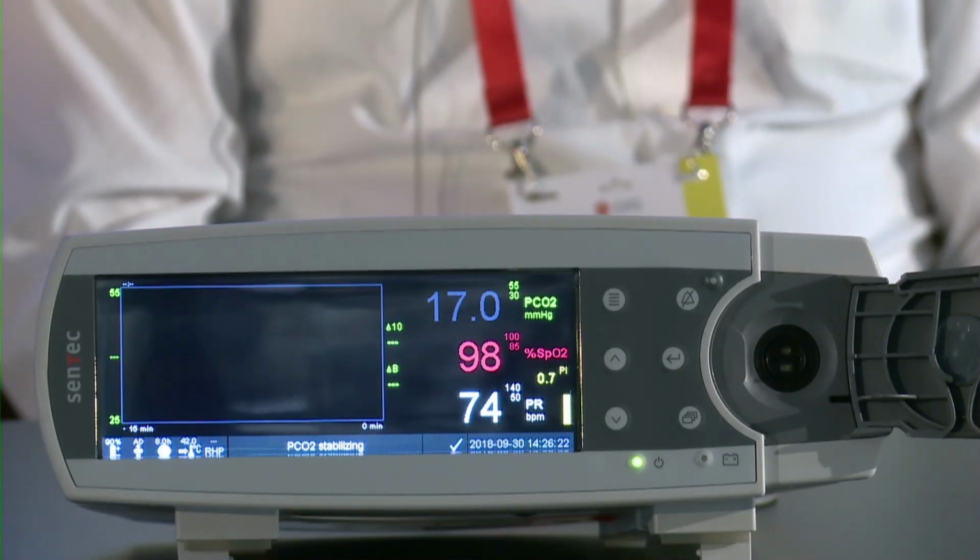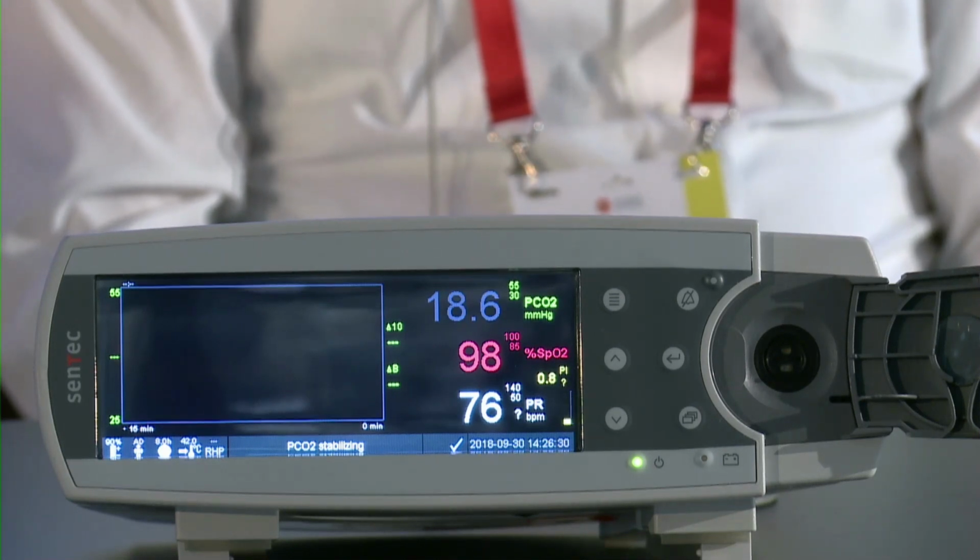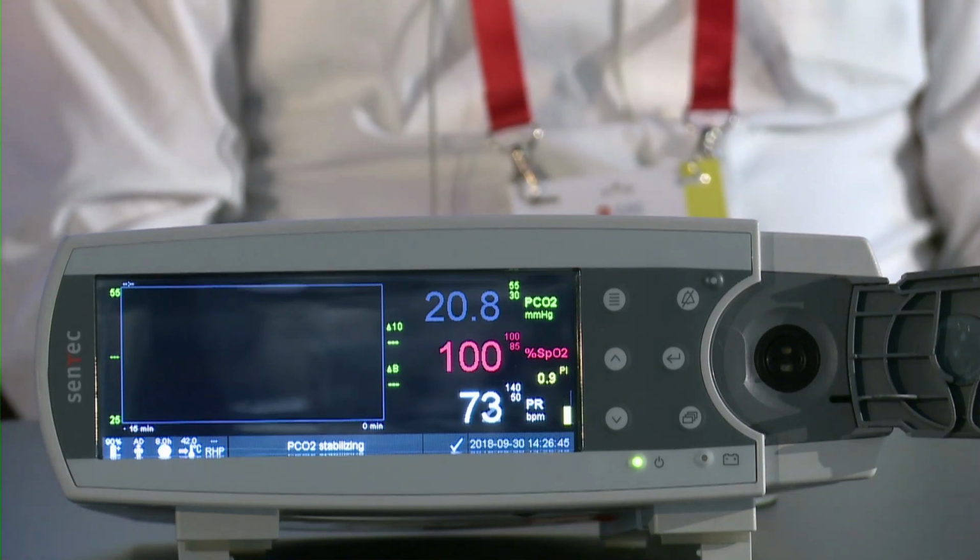Why do we need to stabilize? The measurement principle is that we heat up the local temperature in order to increase the local perfusion. Based on a higher local perfusion, we have better diffusion of CO2 into ambient air. The diffused CO2 is the CO2 we collect in the sensor, and based on that, we can measure the arterial CO2, or an estimation of the arterial CO2.